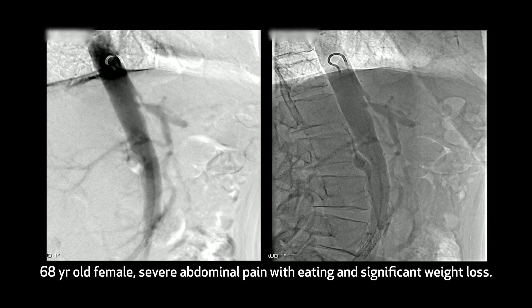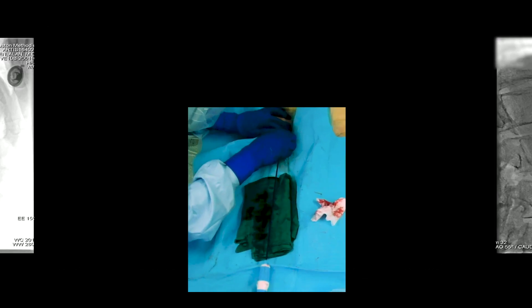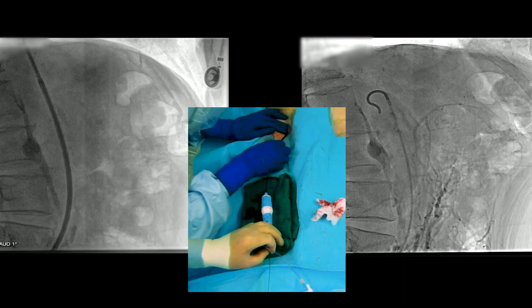It was very difficult to determine whether it was occluded or highly stenotic. Here you can see the aortogram, which shows reconstitution of the distal SMA. There may be collaterals, but there's no obvious direct communication.